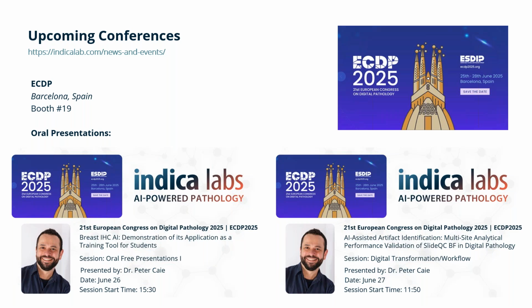Got it. Thanks for running through those considerations, Ghislaine. And let's see, next question is about pixel values here and asking, how do you find the fluorescence intensity data associated with each object or cell? And ask her if we didn't quite get your question here, please let us know, give us clarifying information there. But basically trying to find the specific information on objects or cells in your analysis, Ghislaine, and how you'd find that fluorescence intensity data.